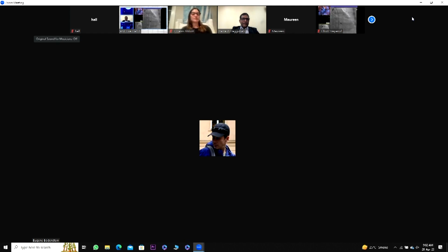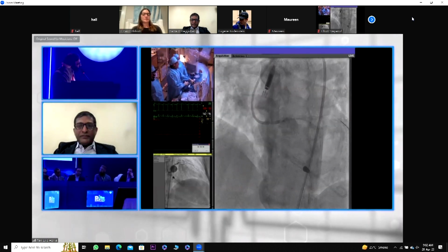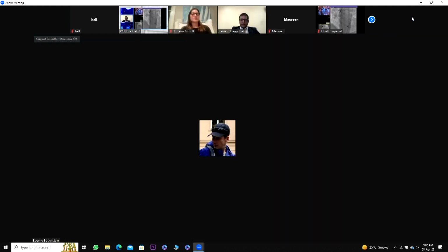Yeah. So another point, and Bilal just pointed it out, we like to place the ostium of this in the left main in the LAO cranial. Which stent are you putting in now from the left main to the LAD? Is it 3.5? It's a 2.8 Xience that we're going to obviously dilate bigger.